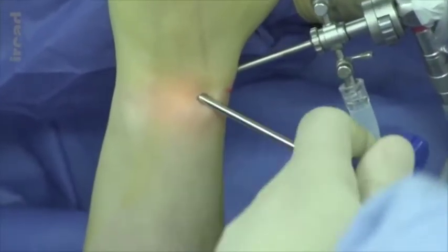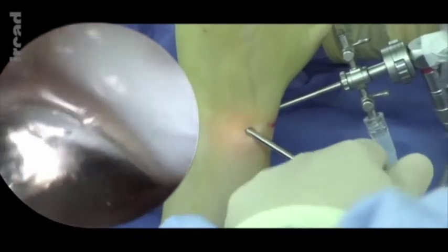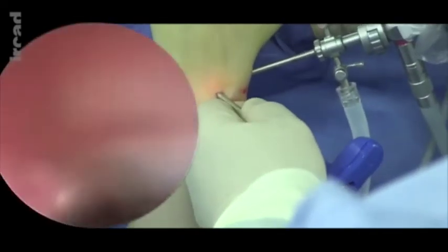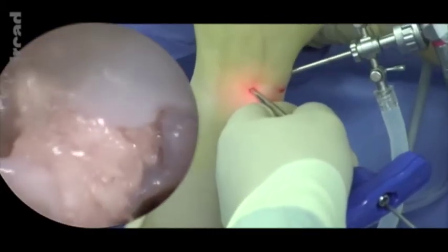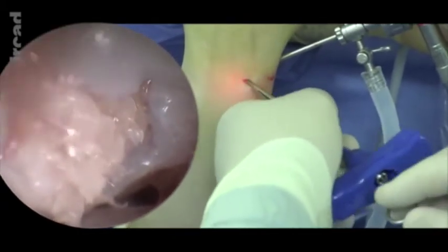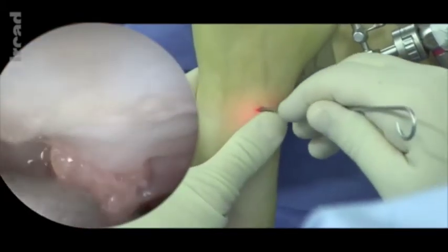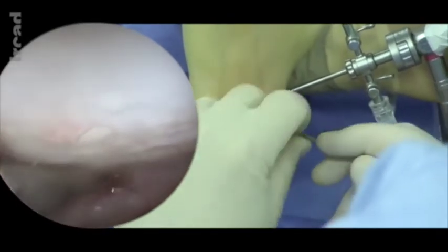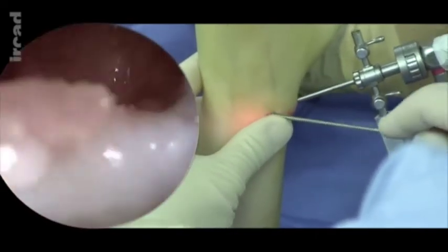The grafts will be pushed inside the lunate bone ganglion without any difficulty. The grafts are adequately packed inside. The Trifin is removed. Using a small graft pusher, the grafts will finally be packed inside the cavity. This manoeuvre is very easy to perform and the scope offers an excellent view.